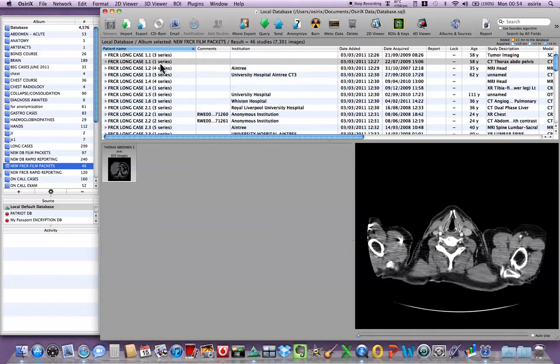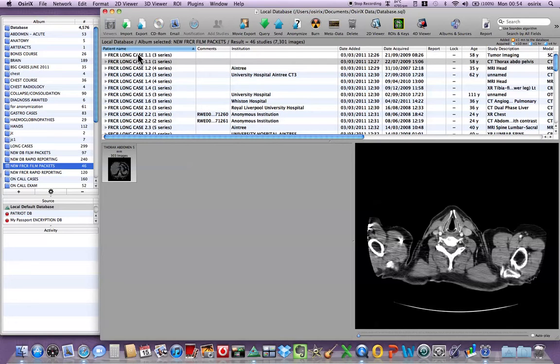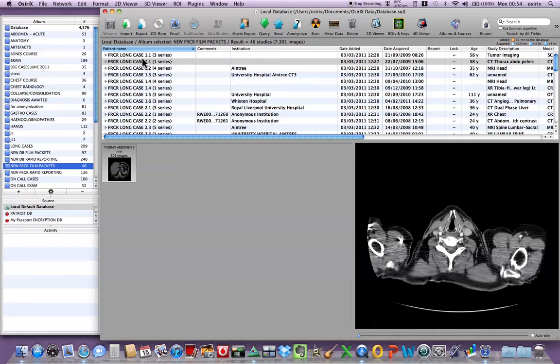Now this is quite an important bit of information because occasionally OsiriX will put the images from a different series on a different line. And you just have to be vigilant that you're getting all the images in case 1.1.